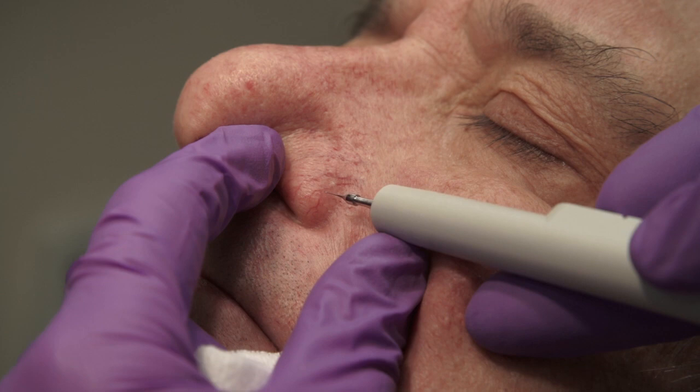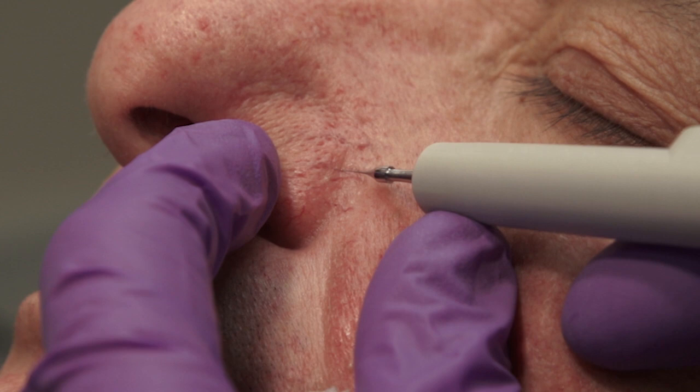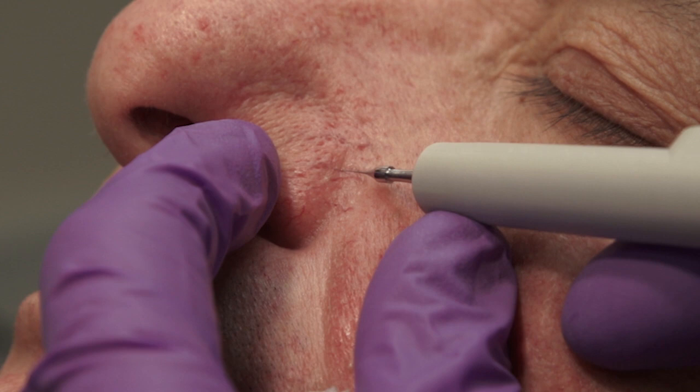As this procedure is done without local anesthesia, the patient will feel the electrical impulse, which often leads to a facial grimace and some tearing of the eye. Note how the telangiectasias become less visible after treatment.